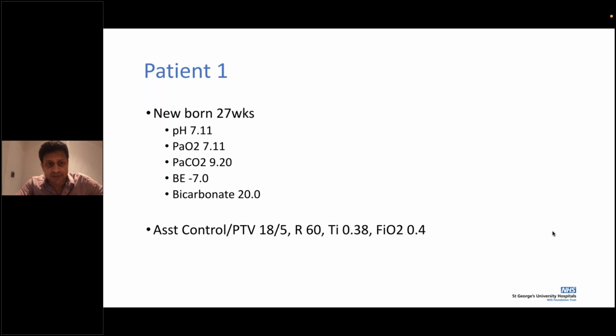Somebody's written about increased PEEP, but I think your thought process is coming from the CO2 being on the slightly higher side. For an increased rate, the rate is already 60, so it's quite a high rate, where you wouldn't be going any higher. In fact, you want to change to volume guarantee. Yay, that's a very good answer.